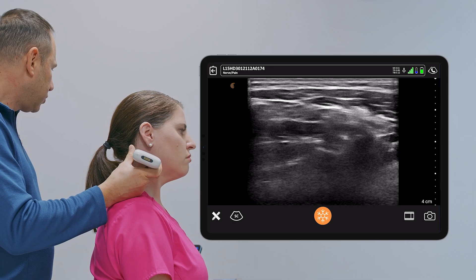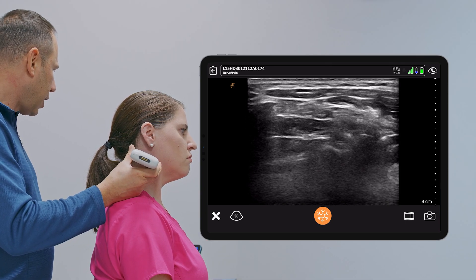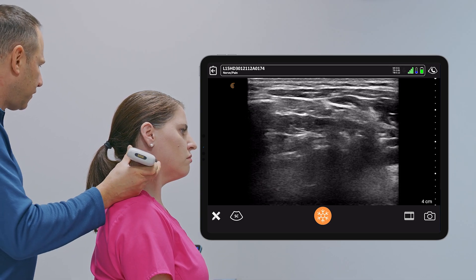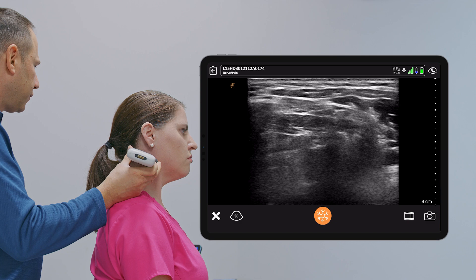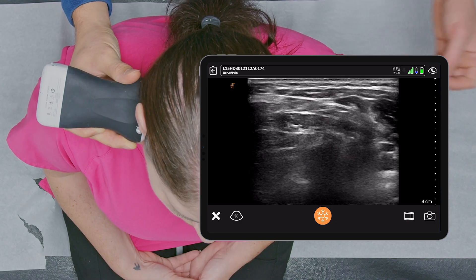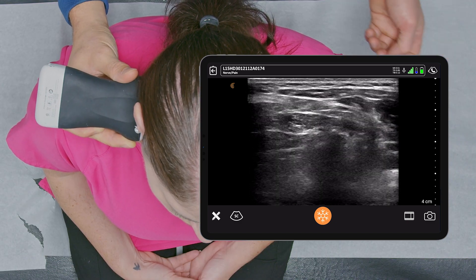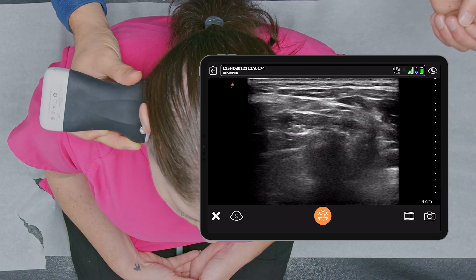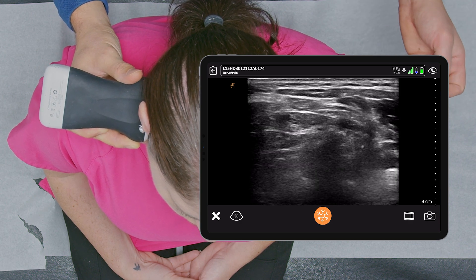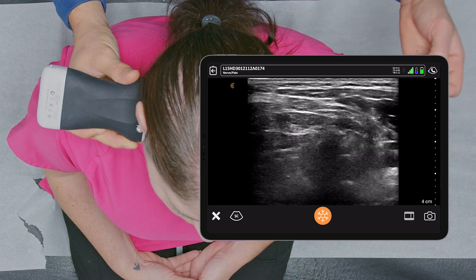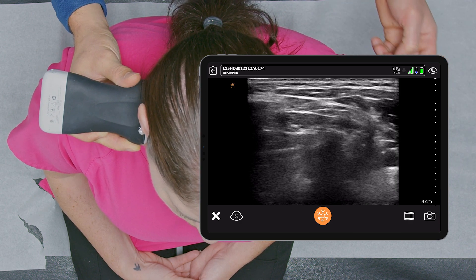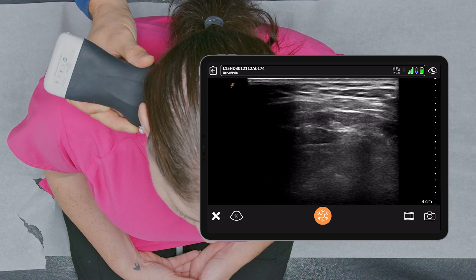Or we could do a superficial cervical plexus block, which gets the transverse cervical nerves — good for post-surgical pain syndromes of the neck or cervicalgia — as well as the supraclavicular nerve, which is ideal for clavicle fractures, and the lesser occipital nerve.